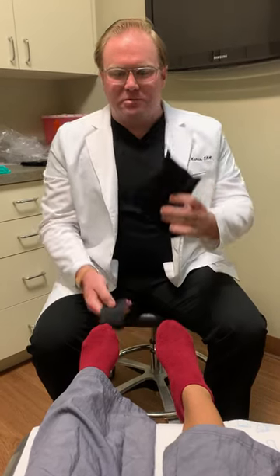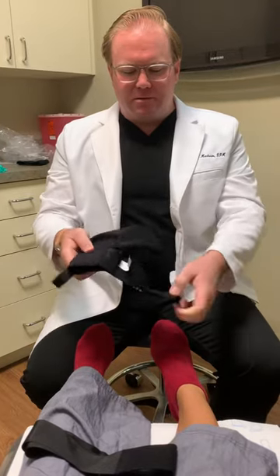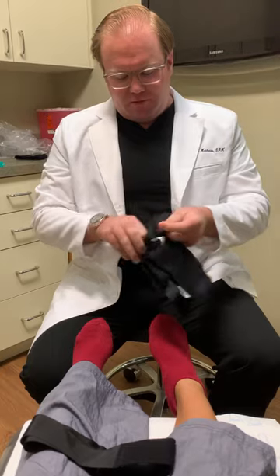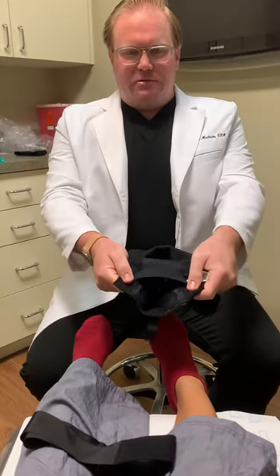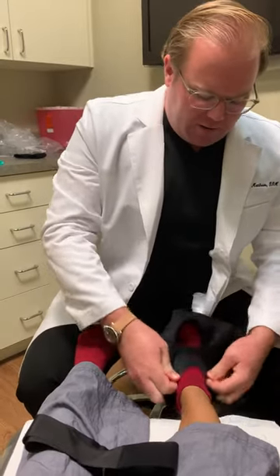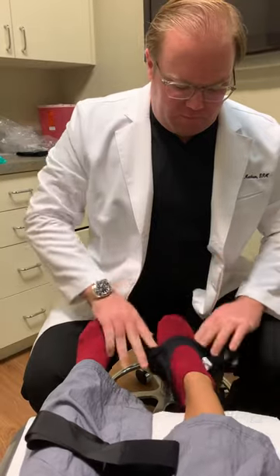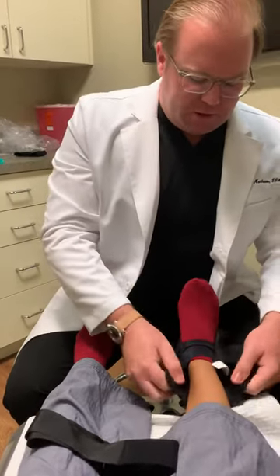There are two components. First is the brace itself — that's a neoprene sock — and second, the strap that goes along with it. So very simply, you take the sock, there are two velcro tabs, you open them both up, and once you've done that it leaves you with this and you simply slide it on your foot just like a sock and pull it up around your ankle, just like so.